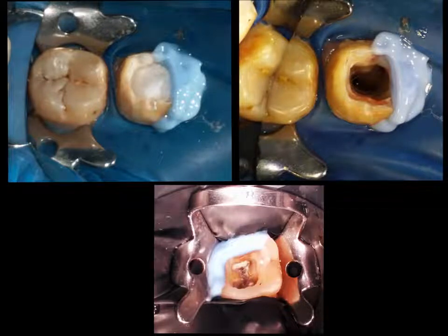Sometimes when we cannot do a pre-endo buildup, we can always close the side walls of open cavities with the help of a resin dam material, which is available as a flowable material that sets once light cure is applied on top of it.